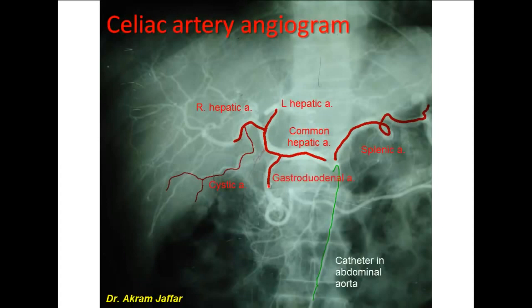The common hepatic artery also provides the gastroduodenal artery. This is the gastroduodenal artery, which passes behind the first part of the duodenum. The gastroduodenal artery provides the right gastroepiploic artery, which courses in the greater omentum along the greater curvature of the stomach.